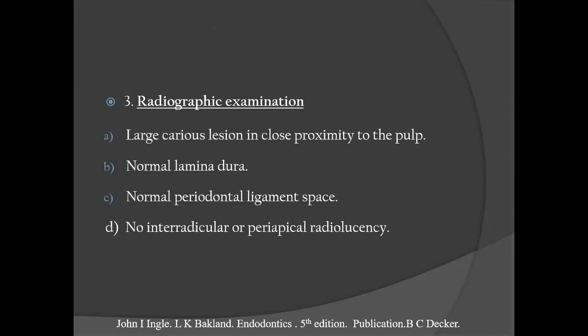Now next is the radiographic examination. First is the large caries lesion, which is in close proximity with the pulp, but it's not involving the pulp. It's not encroaching, it's approximating the pulp. Encroaching means you've already gone in. So it's approximating the pulp, it's not involving the pulp.